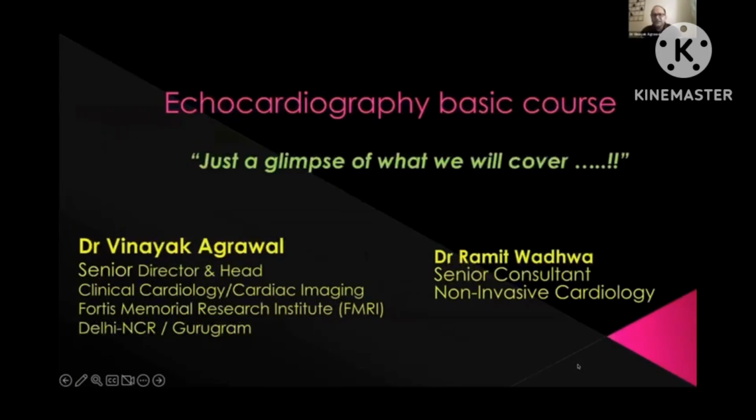What we have designed is a basic echocardiographic course, and the idea is to introduce the basics of echocardiography for beginners as well as people who are already doing echoes but would like to cover it in more detail and in a structured manner. So it's a structured course.